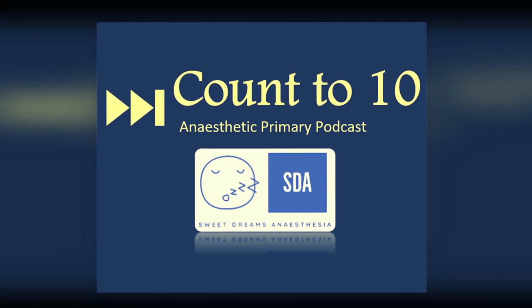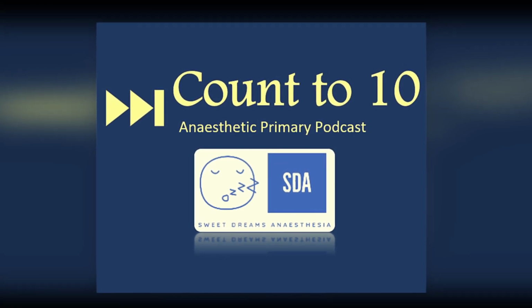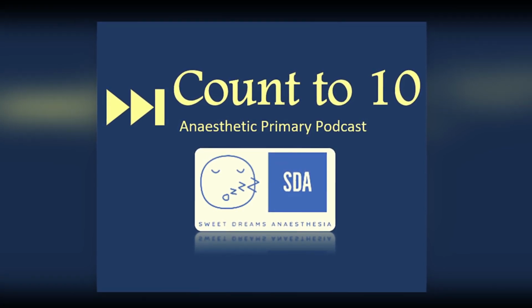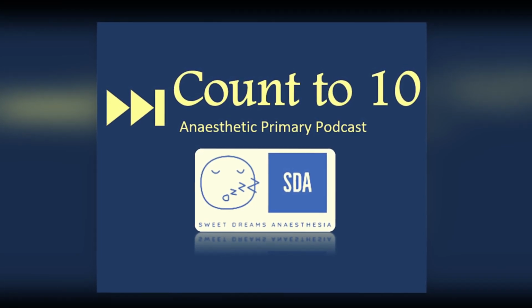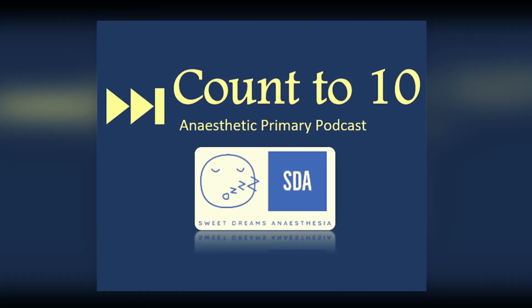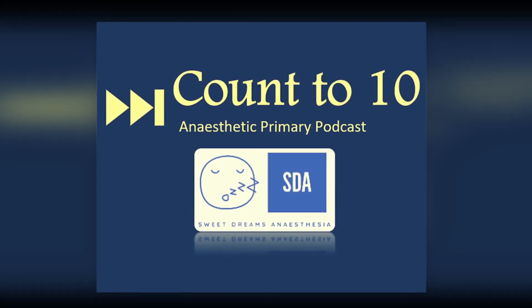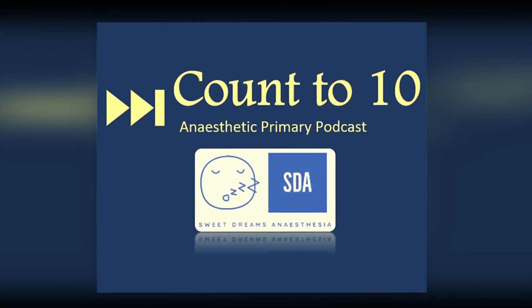Now looking at the oximeter itself, encased within it, we have two high intensity diodes on one side and a photodetector on another side. The two diodes emit a red light at 660 nanometers and an infrared light at 940 nanometers. These numbers are important to remember and unfortunately just a must know. The photodetector on the other side detects the transmitted light and sends this information through to a processor.